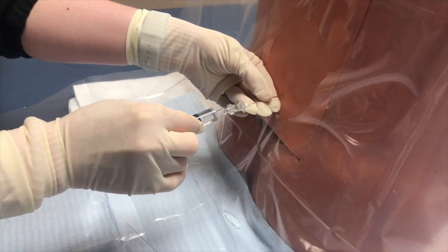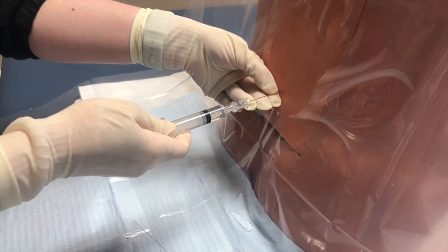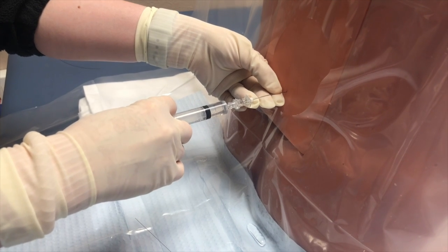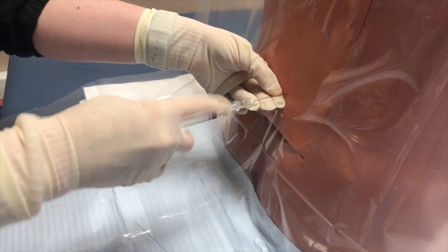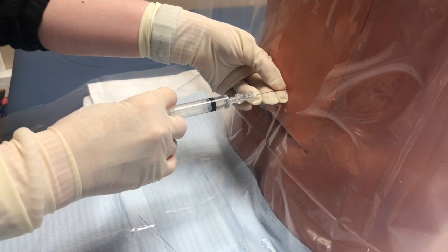At this point, the stylet is removed and several seconds are given for CSF to return through the small gauge needle. After free flow of CSF, aspirate before injecting the local anesthetic slowly at a speed of less than 0.5 mL per second. Incrementally aspirate as you inject local anesthetic, ensuring that you are in the subarachnoid space and that you are not injecting into a blood vessel.